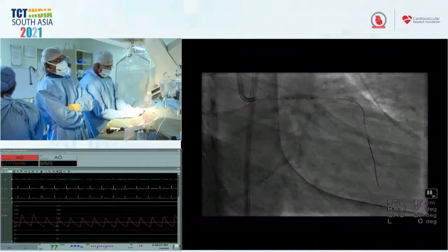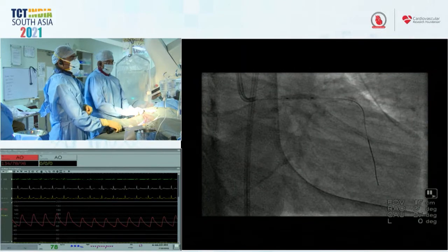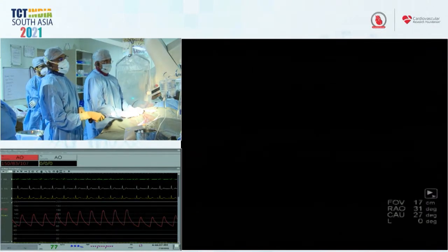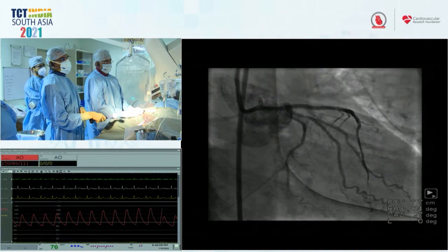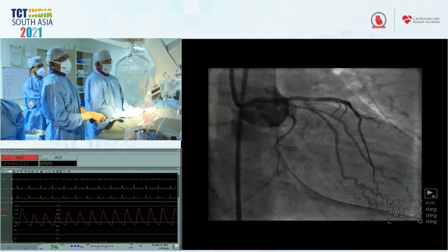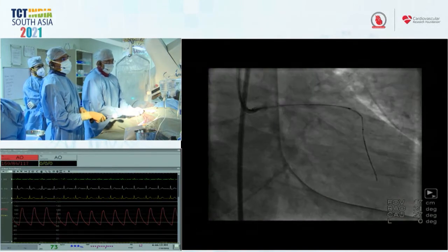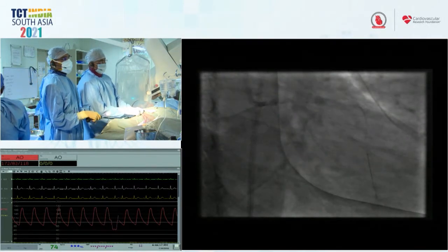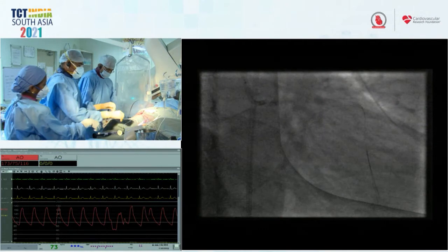Can you show the angiogram, please? Go back to what we did. Let's look at the angio and see if that previous shelf-like structure is starting to look better, I think. Just show the cine image now. We didn't record any, so we'll take a shot now for you.